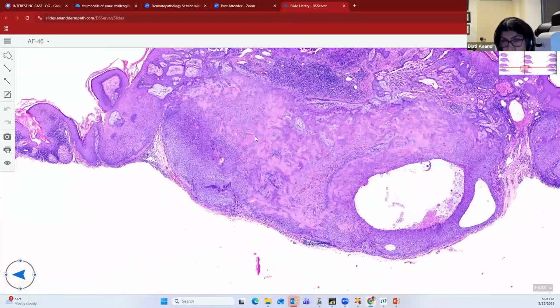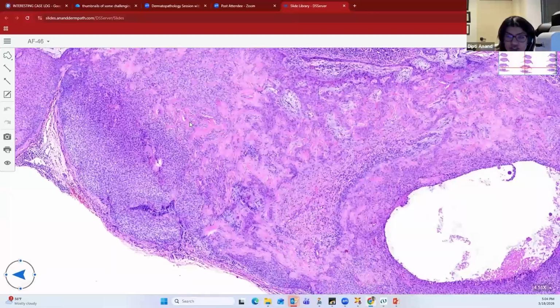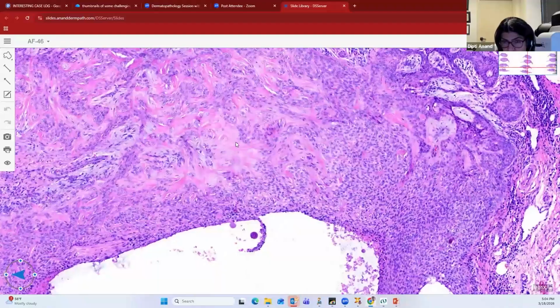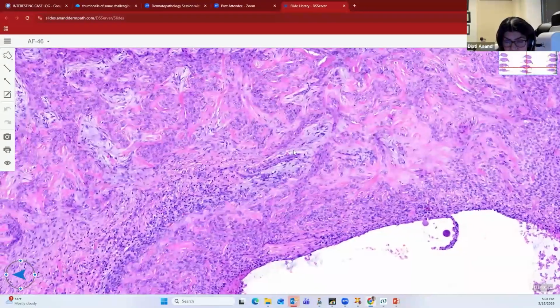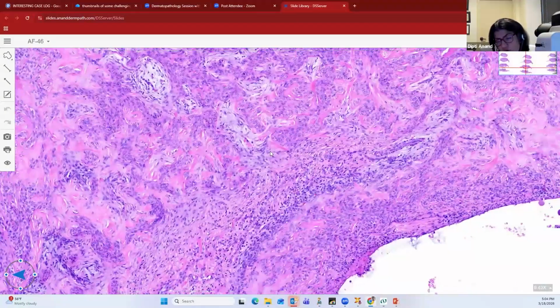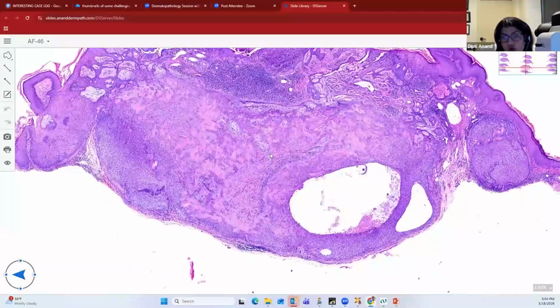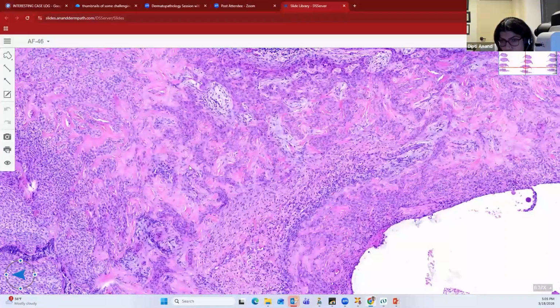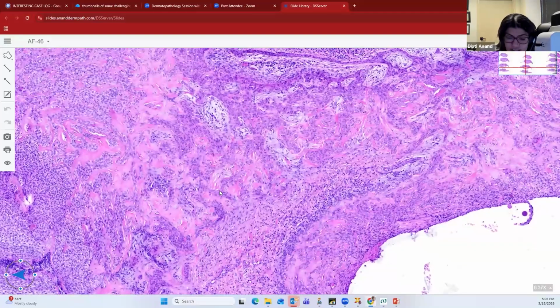which is what you would see in a trichilemmoma or trichilemmal verruca. Now, because the lesion is big, the center portion of the tumor often shows these infiltrating nests and cords of islands which appear to be present in a hyalinized stroma. That's called a desmoplastic trichilemmoma or desmoplastic trichilemmal verruca. Where the edges are smooth, you will see the picket fencing of the basaloid cells and the inner jumbled up clear cells, but at the center, as it grows, it shows these tumor islands which are caught up in this hyalinized stroma. So that is your desmoplastic trichilemmoma.